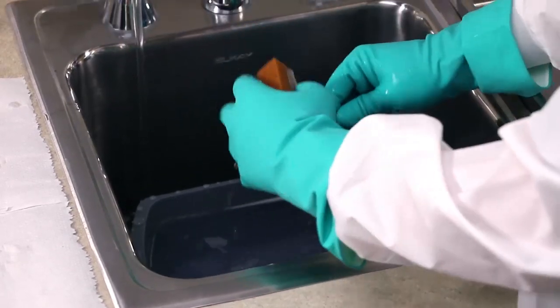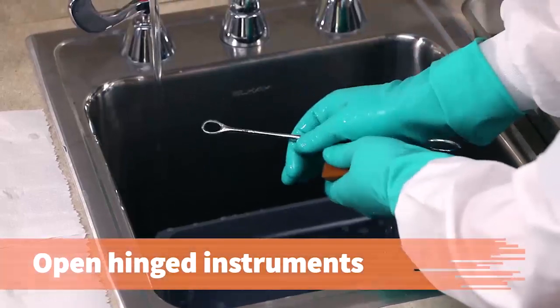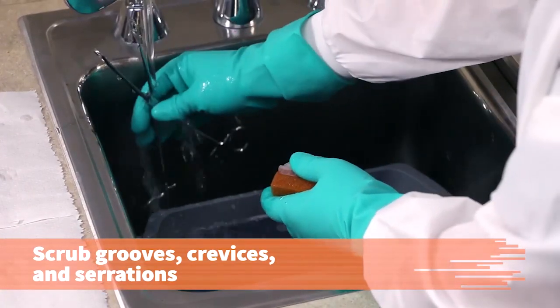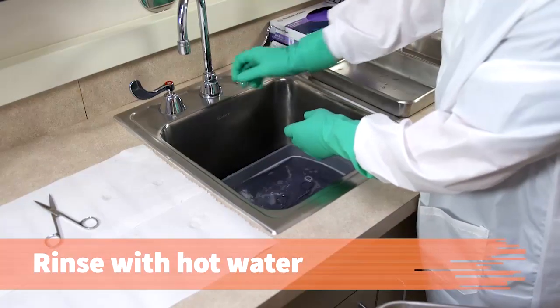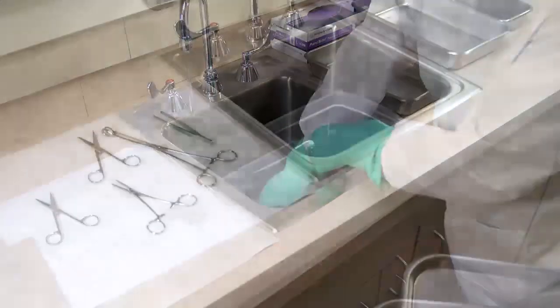Microorganisms can hide under contaminants and may not be destroyed by the disinfection process. So open hinged instruments and scrub all grooves, crevices, and serrations with a disposable brush. Rinse well with hot water to remove all soap and contaminant residue.